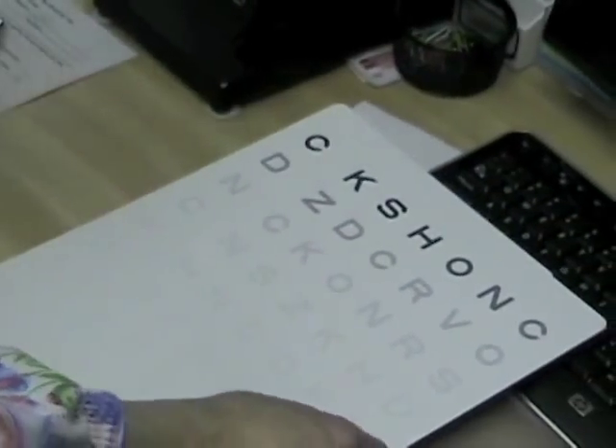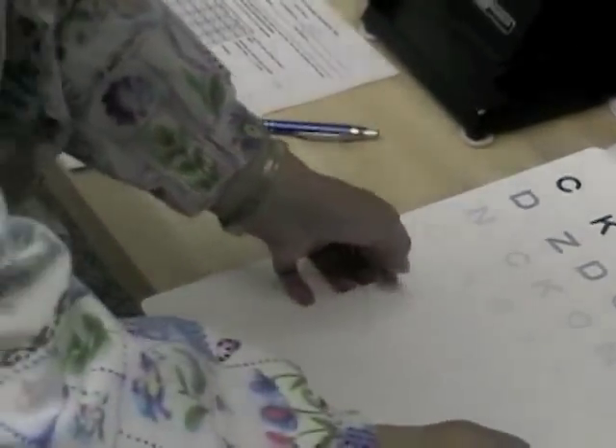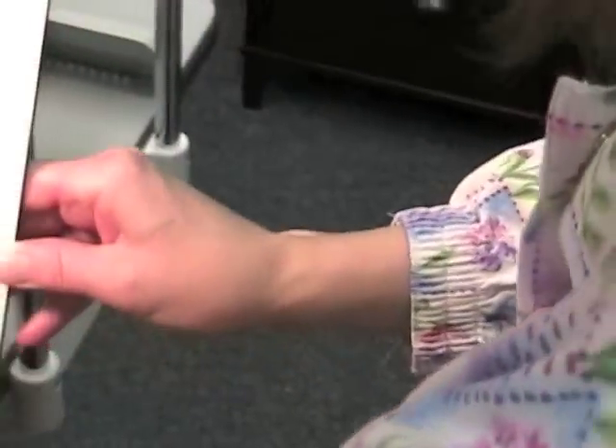Okay, well you did great. What we're going to be doing next — let me just write this down — we're going to be going on to the next eye. If you could cover the other eye.